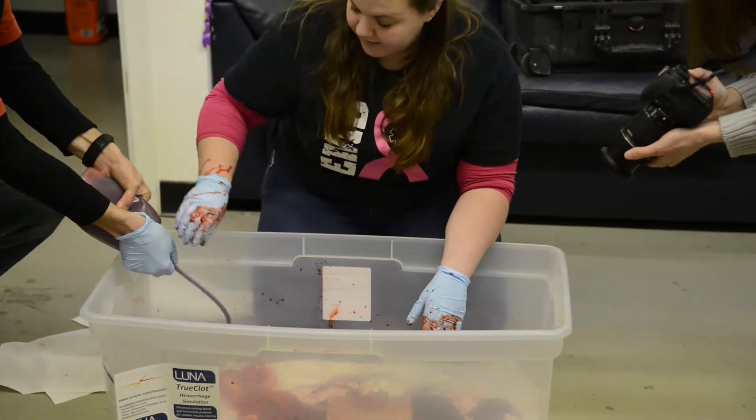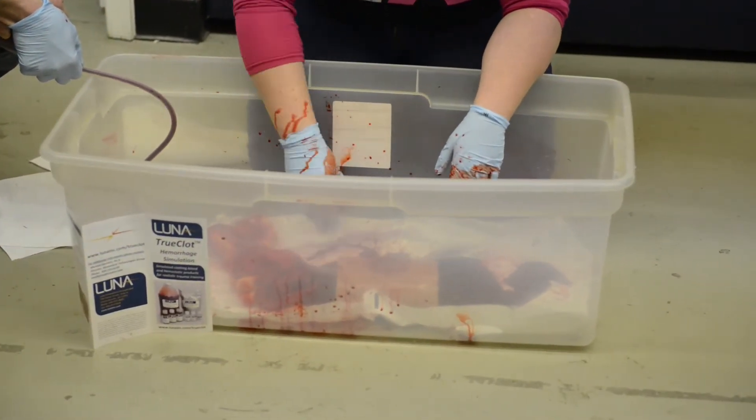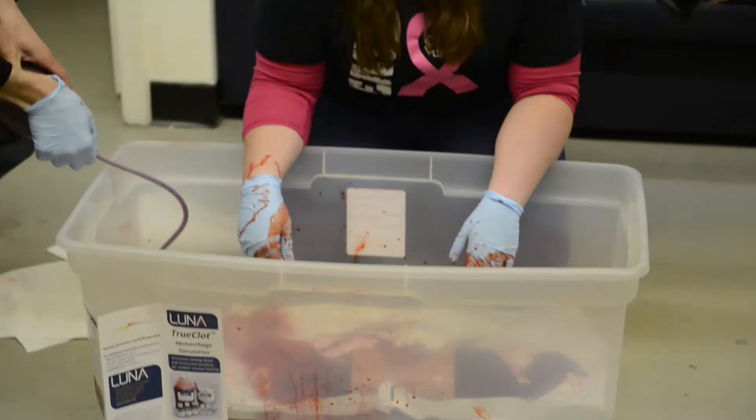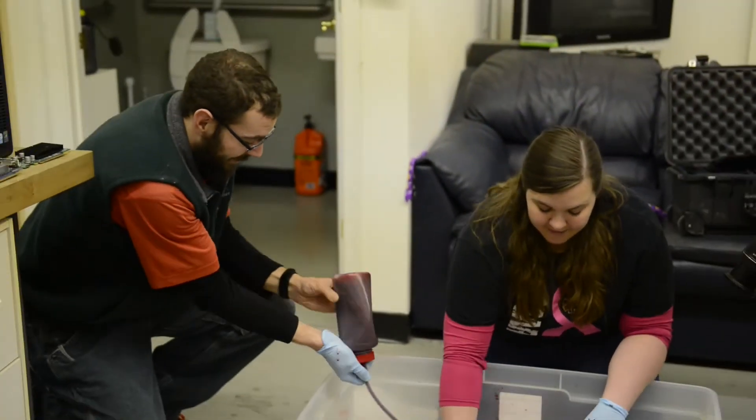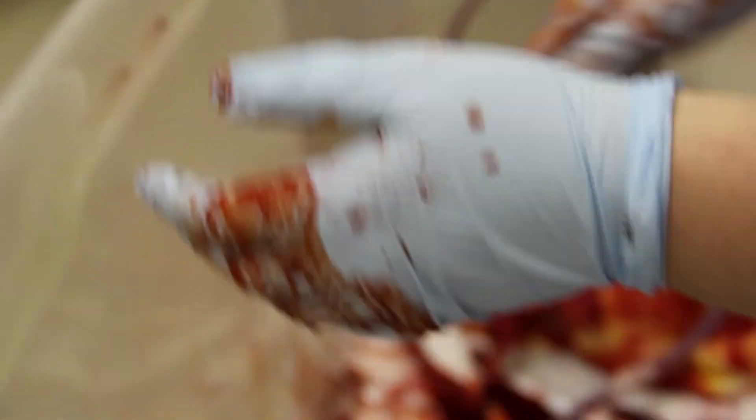He's still squeezing, but we've stuffed enough gauze in there — it's clotted enough that we are now blocking the flow. It is not going anywhere. If we pull it out, you can see all of the clots that were created. This is what's going to happen with a QuickClot system, and this is what you want. In an EMS situation, clots are good — you want it to stop. You don't want somebody to bleed out. You really don't want to have to apply a tourniquet if you don't have to.